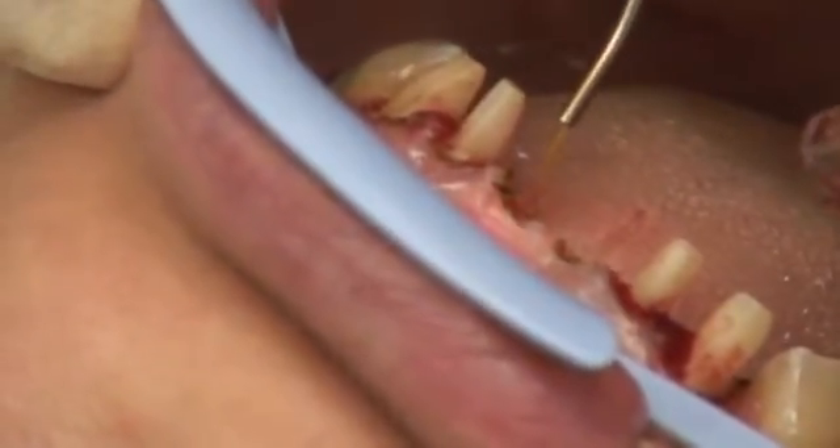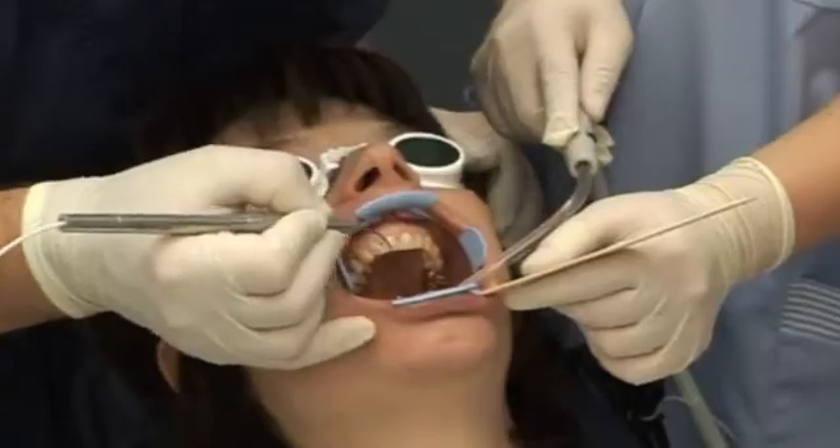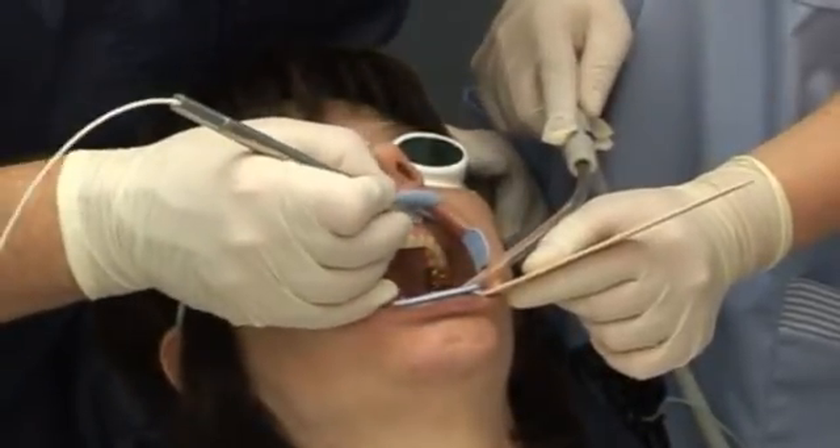You can position the soft tissue very well, just as you need it for your end result. Caution: always work parallel to the tooth surface.